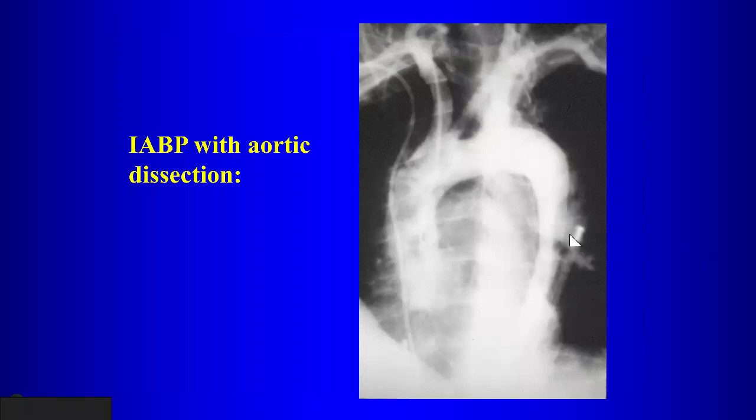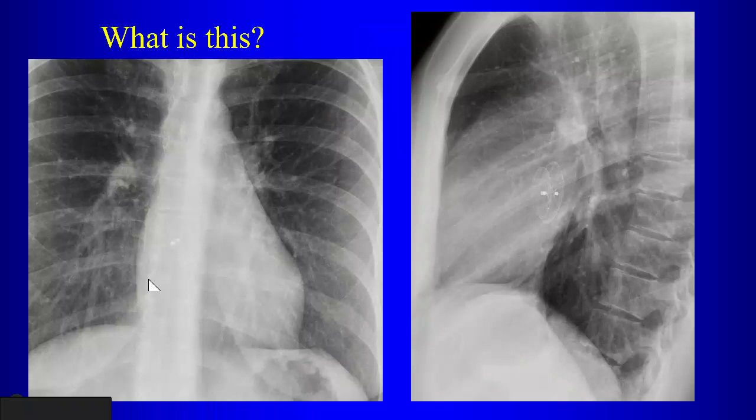It's a dissection. While they were placing the pump, they placed it in a false lumen, and the balloon is now expanding within a false lumen. So it's a dissection. Okay.